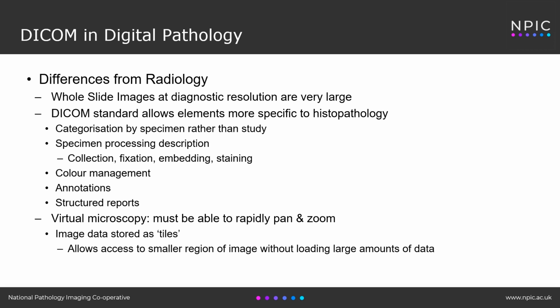There are a number of fundamental differences between imaging in radiology and digital pathology that require a different approach, and it's probably useful to mention some of these at this point. Firstly, whole slide images are very large in terms of the file size. It does vary, but with compression for a whole slide image, we're talking in the region of 300 to 500 megabytes. But this can be much larger depending on the maximum scanning resolution or whether the more complex Z-plane scanning is used, and this may lead to issues with storage and network capabilities.